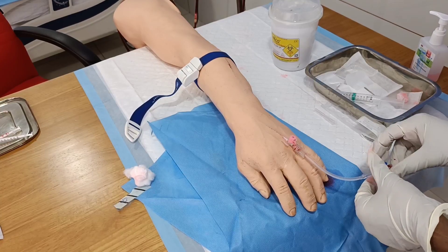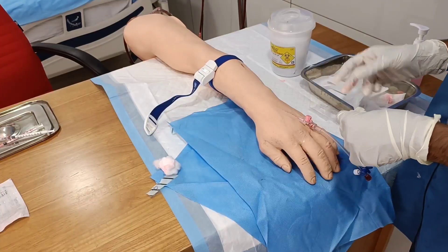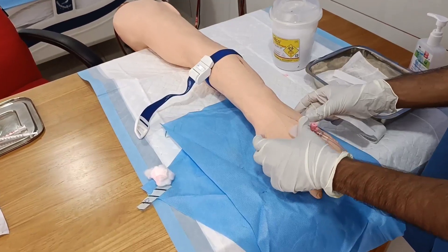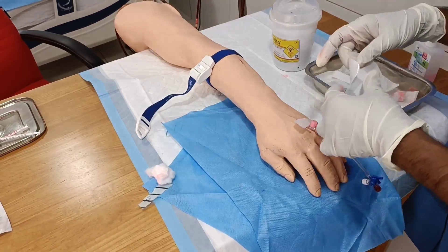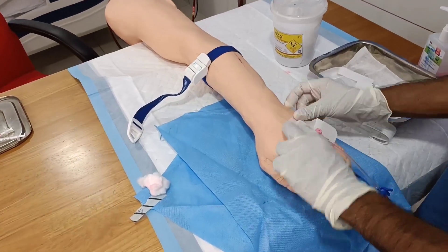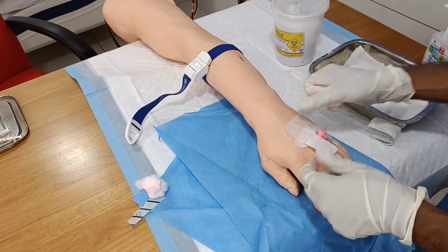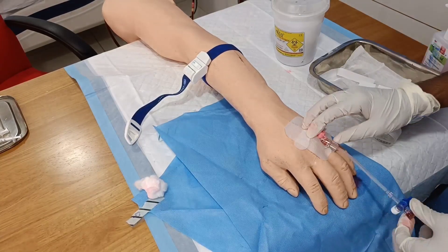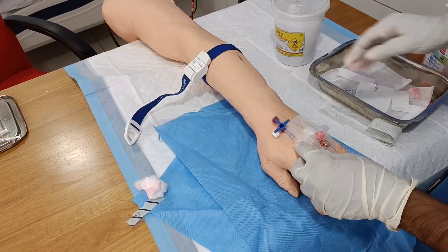Once confirmed, anchor the IV cannula with a tegaderm plaster. Properly seal it with the IV tegaderm. Open the pinch clamp, and for better fixation, apply some additional transport plaster. This completes the procedure of intravenous cannulation.